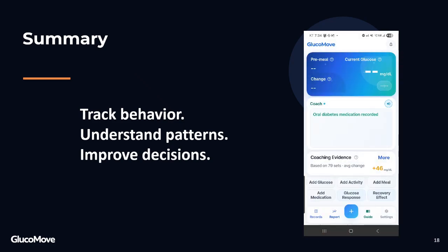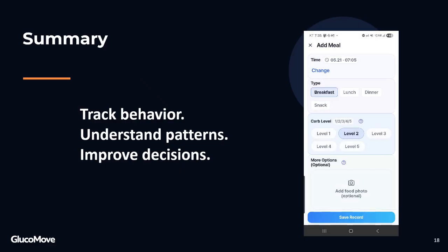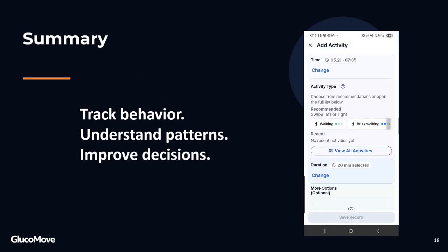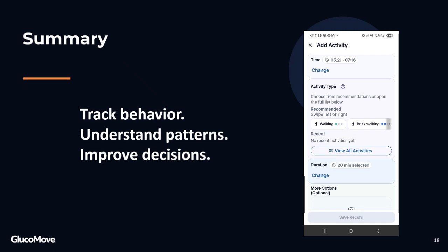Why do so many people understand the importance of fasting glucose and 2-hour post-meal glucose, yet still struggle to manage them consistently in a structured way? GlucoMove began with this simple question. Glucose management is a lifelong challenge, and it is not something that can be solved easily or quickly. However, with better understanding, better context, and more consistent behavioral patterns, users may be able to support long-term glucose management more effectively over time.